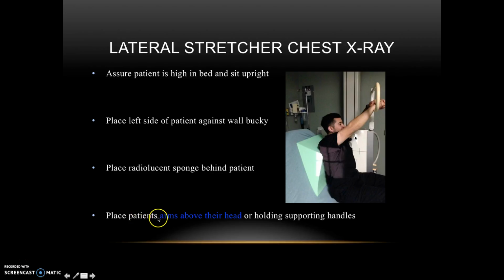And we're going to place the patient's arms above their head, holding or supporting some handles here, so their arms won't be in the way of the lungs. And again, we're going to mark the film and place a lead shield.